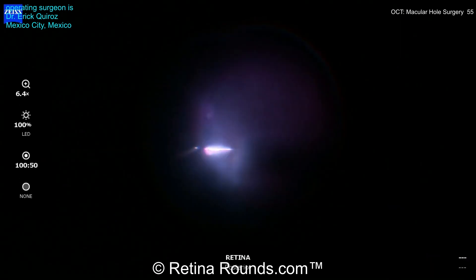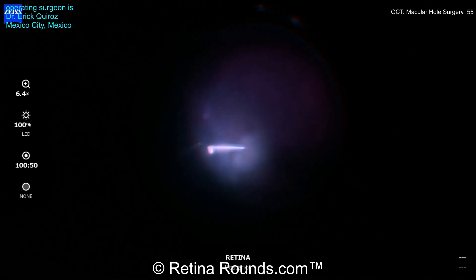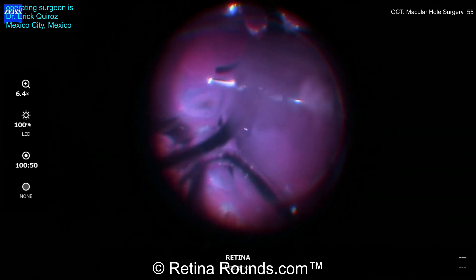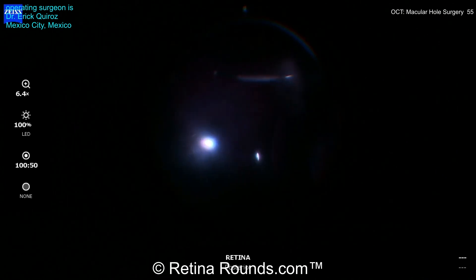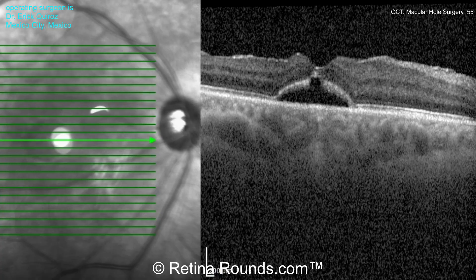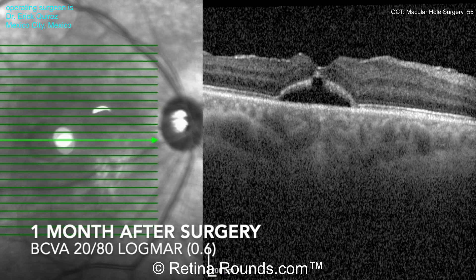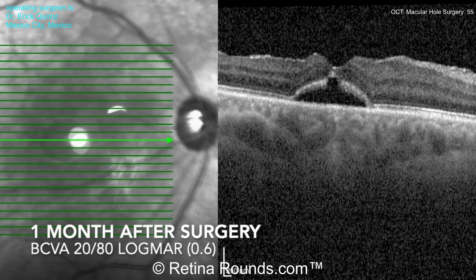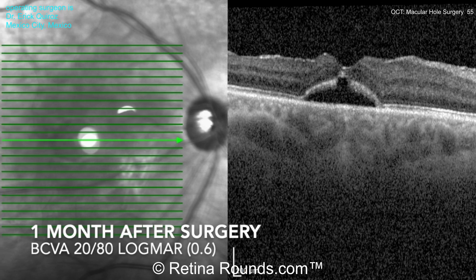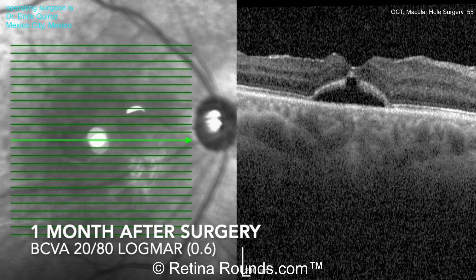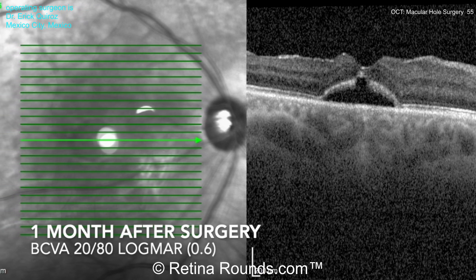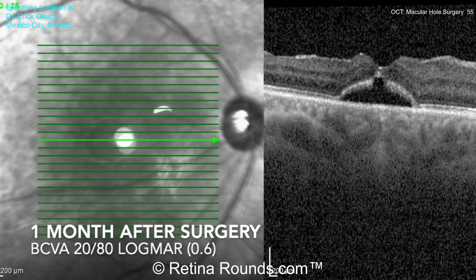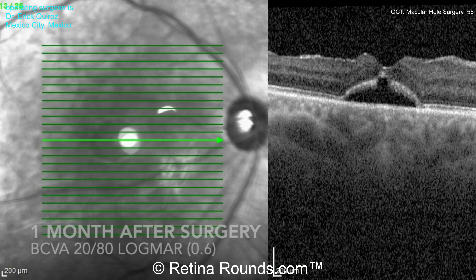An air-fluid exchange is performed, and SF6 gas at a concentration of 20% is implanted into the vitreous cavity. The patient will be kept in the face-down position postoperatively. Here's the patient's postoperative OCT at month one: visual acuity has improved to 20/80, and the macular hole is closed, although there's still some discontinuity of the outer retinal layers and a small cuff of fluid underneath the now-closed macular hole, which will hopefully improve with time.